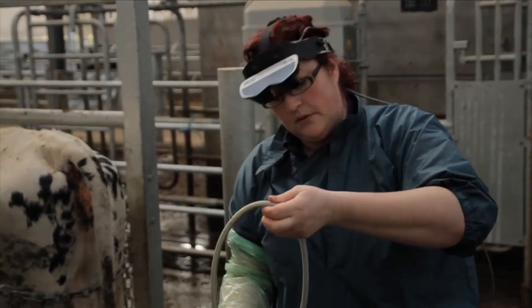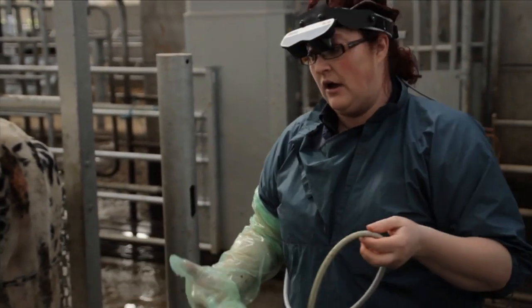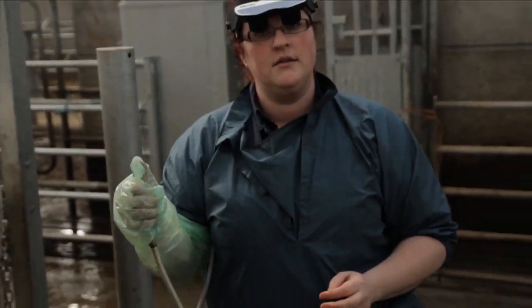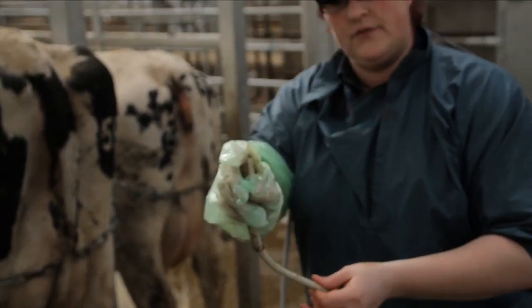You notice that I keep the ultrasound probe, the head of it, away from any potential hazards at all times. We'll now grasp the probe again, get some more lube. Thank you. Lubricate the surface of the probe.